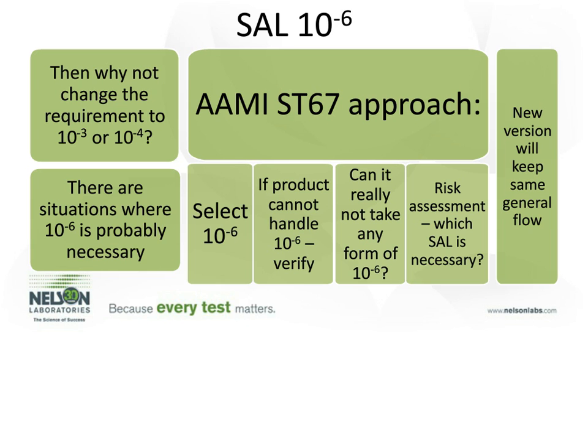But in an effort to provide a structure for some of these new innovative combination devices, medical devices, biological products, and tissues, we want to provide something to go to, where manufacturers have something rather than having to default automatically to aseptic processing.